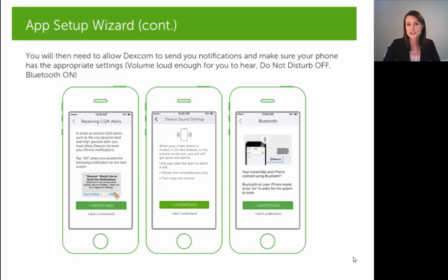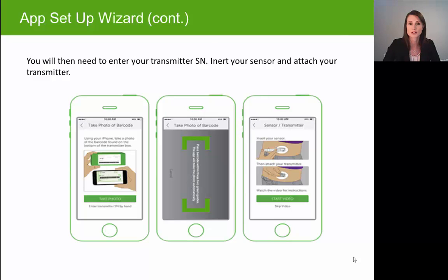The next screen will explain that your G5 app communicates with your transmitter via Bluetooth, so you want to make sure Bluetooth is turned on on your smart device at all times. The app will then ask you to enter your transmitter ID, which you can find on the back of the transmitter or on the box it came in. It's a series of six letters and numbers that starts with a four, and you can enter it one of two ways: by taking a photo or entering the transmitter serial number by hand.